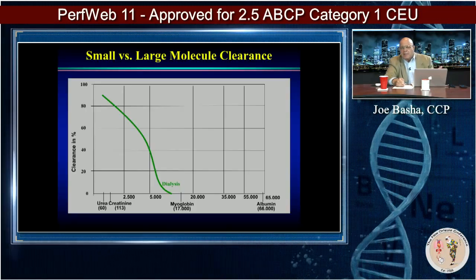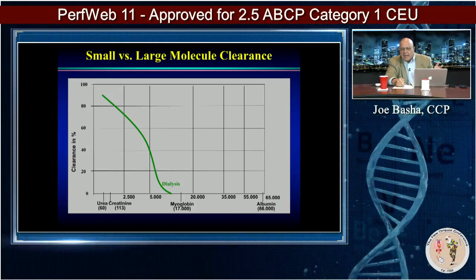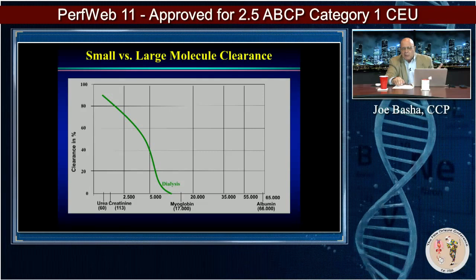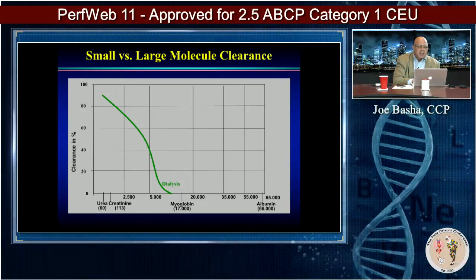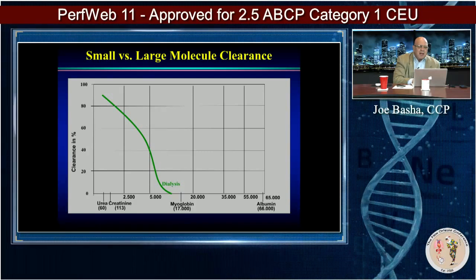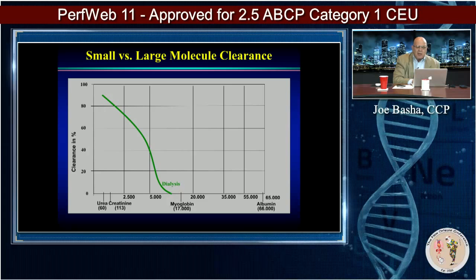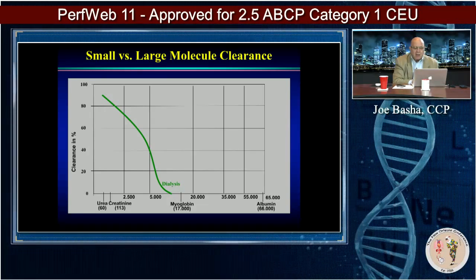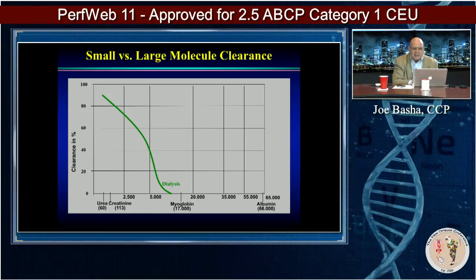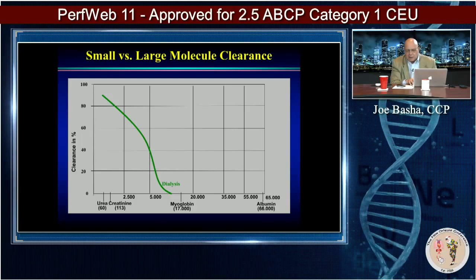But what does that all mean to us? Well, you look at dialysis. Dialysis essentially removes what you see there. If you look at the top part of this right here, very small molecules, and then as the molecules get larger and larger, well, dialysis diffusive clearance cannot clear it. So by the time you get to myoglobin, actually under myoglobin, at 17,000 Daltons, dialysis absolutely cannot clear that.